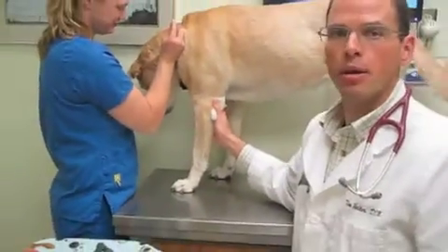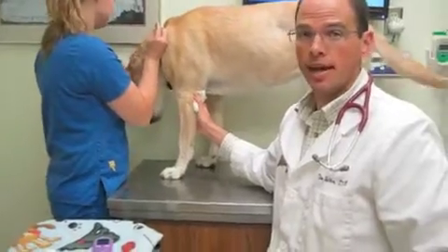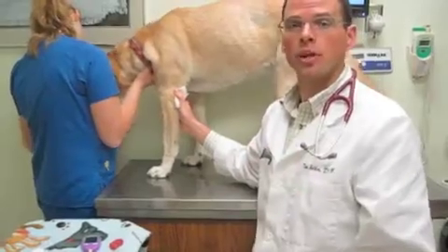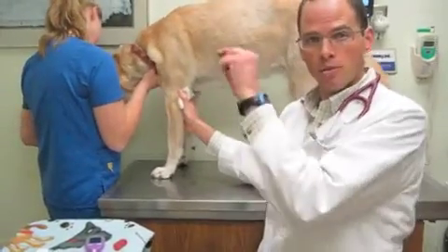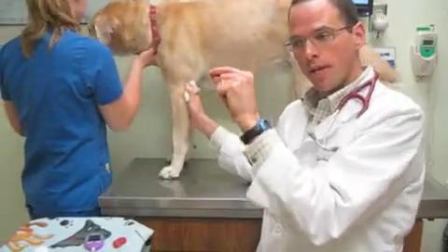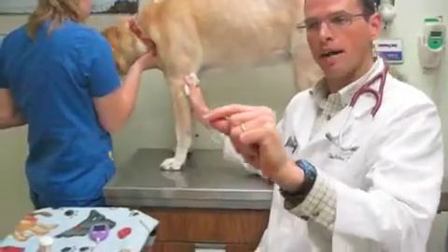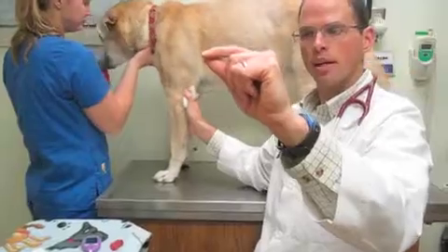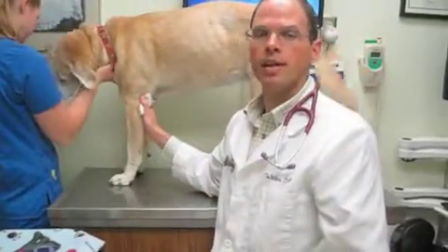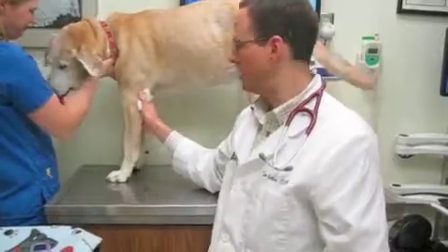Your veterinarian may have you do this twice a day at meal time, and occasionally will have you do a curve over 12 hours — where you take a level in the morning when you feed, you give insulin, the blood sugar will come down through the day, and come back up when you're ready to feed 12 hours later. Taking a sample every two hours will allow your veterinarian to see how well your pet is regulated.